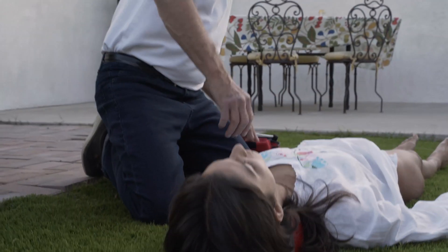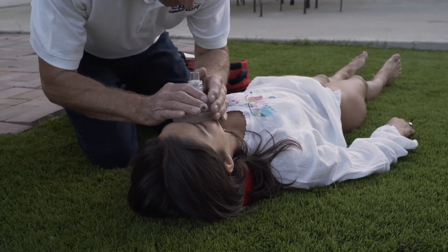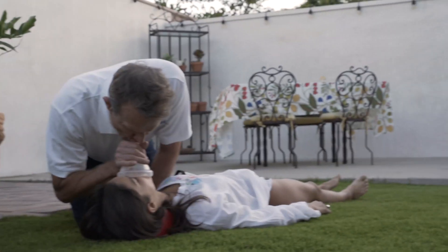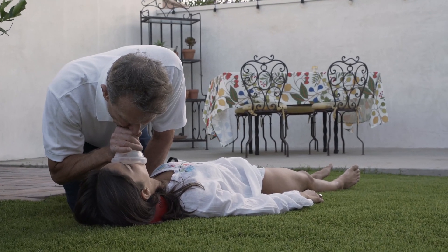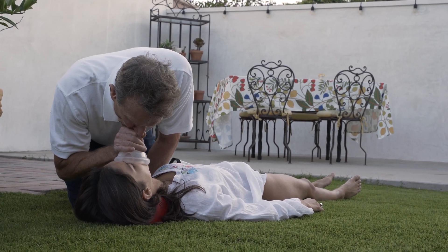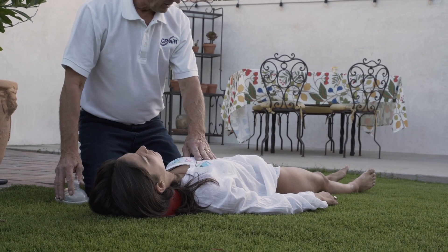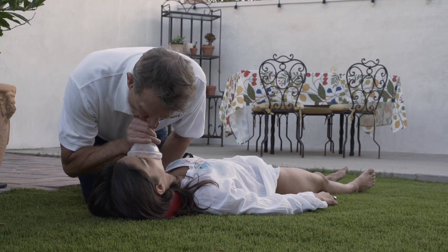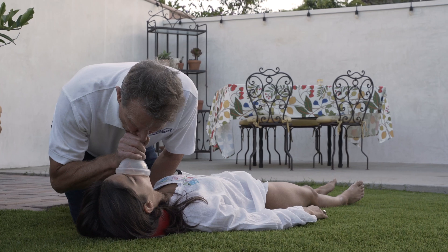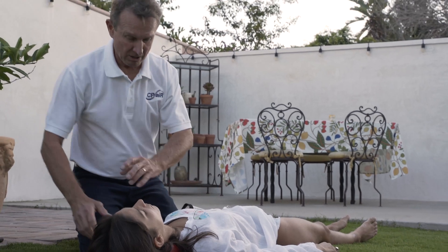Stop. Now, firmly grasp the face mask, place the mask over the person's mouth and nose, and press firmly onto the face. If you are unable to perform the rescue breathing, maintain continuous chest compressions during the rescue breathing parts of this procedure until professional help arrives. Now if you're able, blow a deep rescue breath through the mouthpiece of the mask, big enough to make the person's chest rise. Let the person's chest fall, then repeat with a second rescue breath. If at any time during this procedure you see liquid coming from the person's mouth or observe choking, quickly remove the mask and roll the person onto their side.